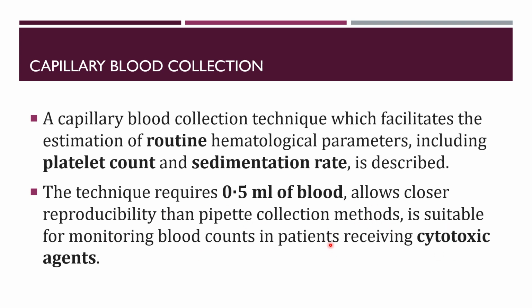Sometimes capillary blood collection is also used in patients on cytotoxic agent therapy. This method is widely used for routine purposes, in which a very small amount of blood sample is required. Such as, I think UHC and PSC centers are mostly using this kind of technique of blood collection.